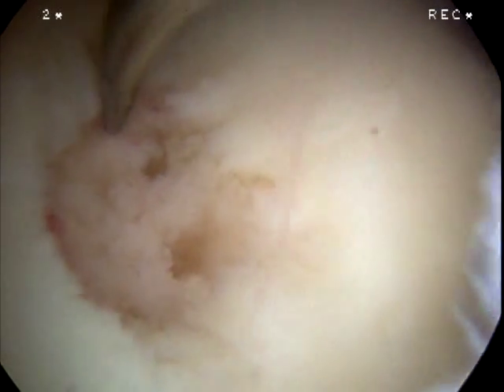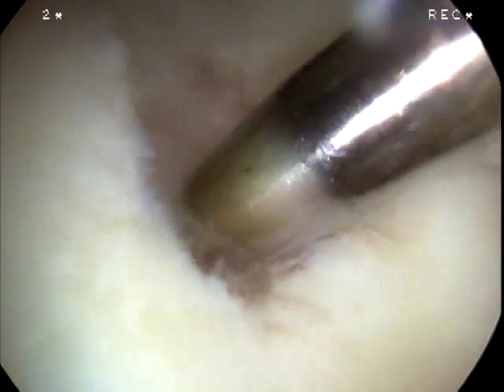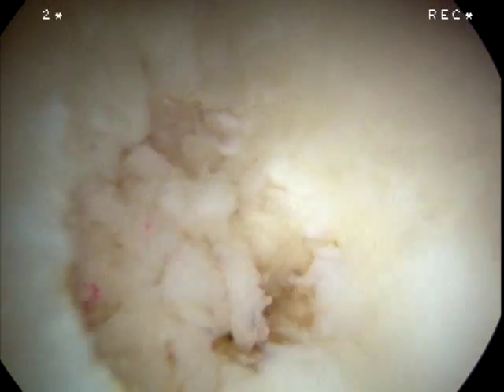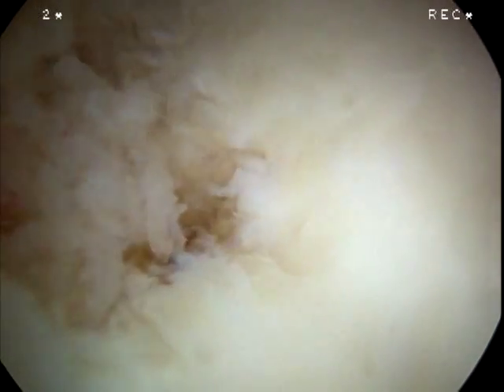Sometimes when performing this procedure, a subchondral cyst is encountered. It's important to try to remove that cyst and to bloody the complete base of the lesion. This is especially true in OCD lesions or lesions that have previously been treated with other forms of cartilage replacement.